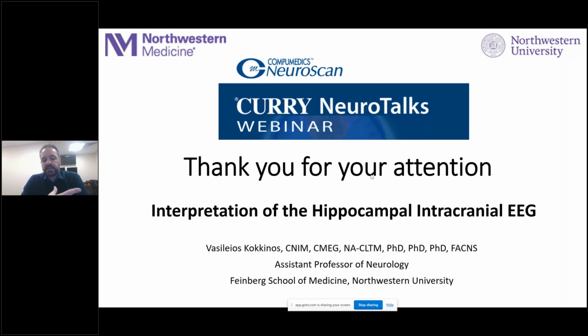However, given the fact that in the surgical evaluation there is almost always something outstanding on a case by case basis, this standardized template is complemented by other, non-standard coverage. And at the end, even if we're dealing with the same syndrome, no two stereo EEG implants are identical. Hopefully that answered your question. It does.